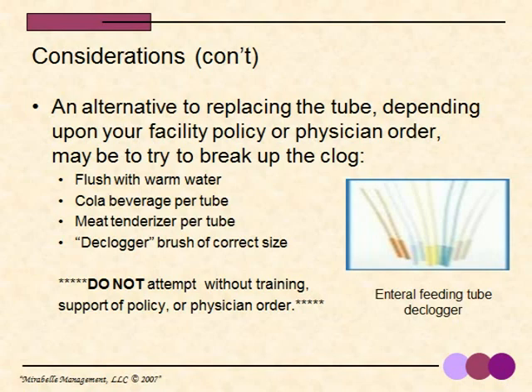I want to emphasize that you are not to attempt or do this procedure without specific training from your nurse, without the support of policy in your facility, or a physician's order.